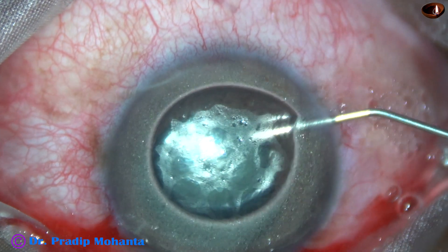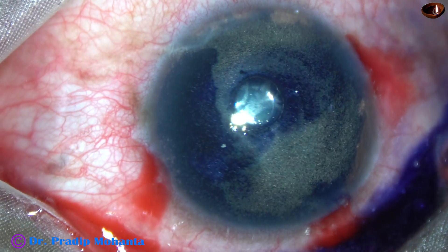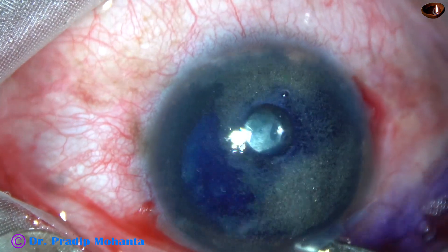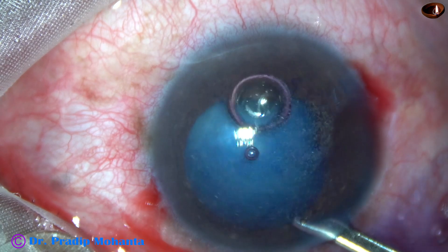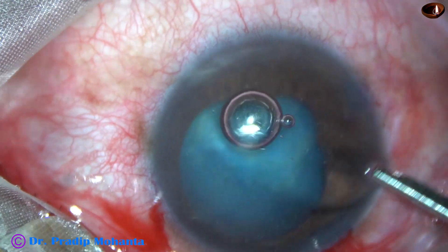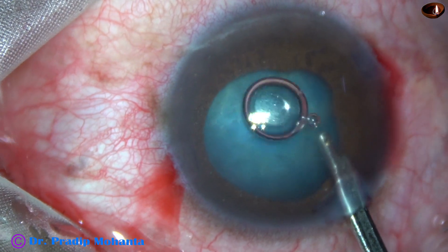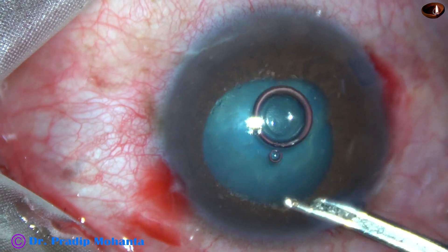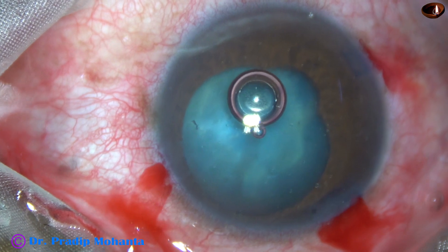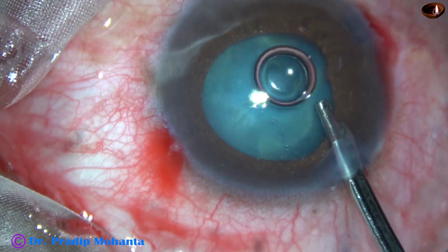The trypan blue dye is applied over the anterior capsule. The air bubble has come out. The silicon oil as well as the dye is washed out, and we can see the white mature cataract. We can also see two areas of posterior synechia — one is at 6 o'clock and the other one is at around 9 o'clock.